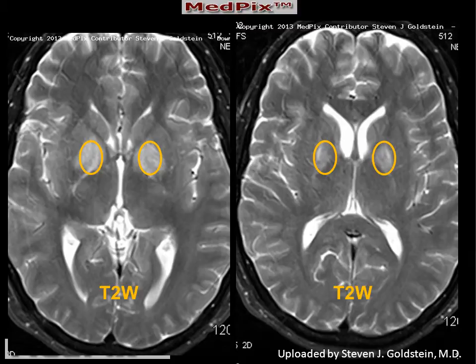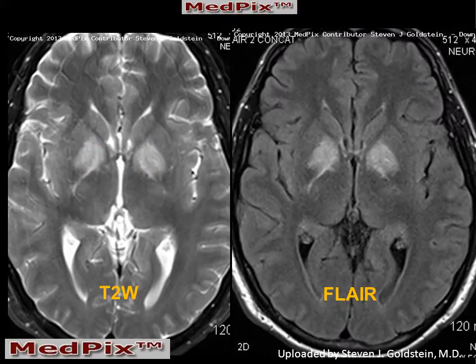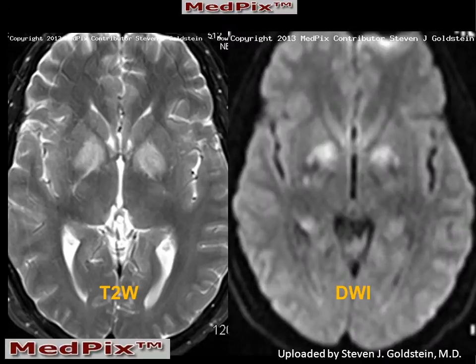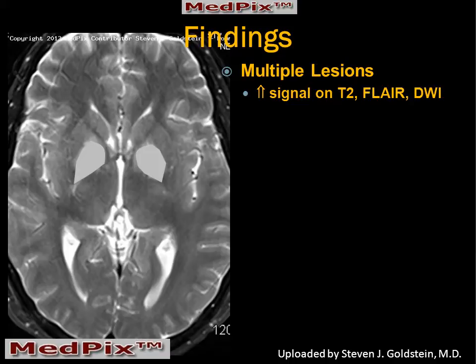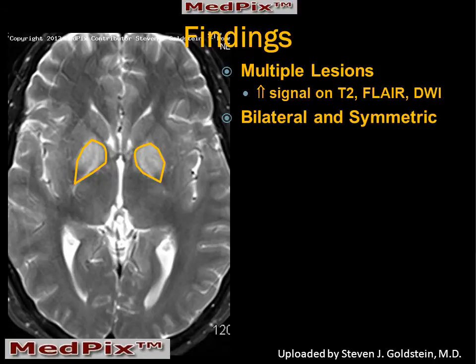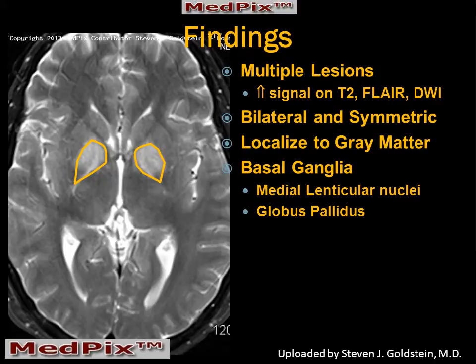We can see these on T2. We can see the same corresponding lesions on the FLAIR image. And we can also see that there is restricted diffusion in the globus pallidus bilaterally. So the findings in this case are multiple lesions consisting of increased signal on MR and decreased attenuation on CT. They're bilateral and symmetric, localized to the gray matter of the basal ganglia, and most particularly, involving the globus pallidus.